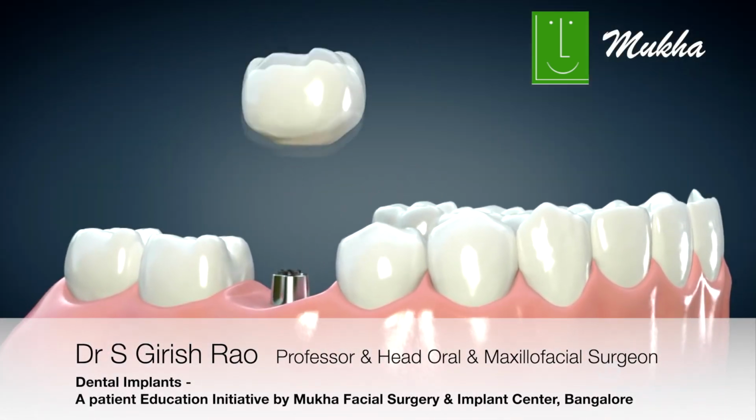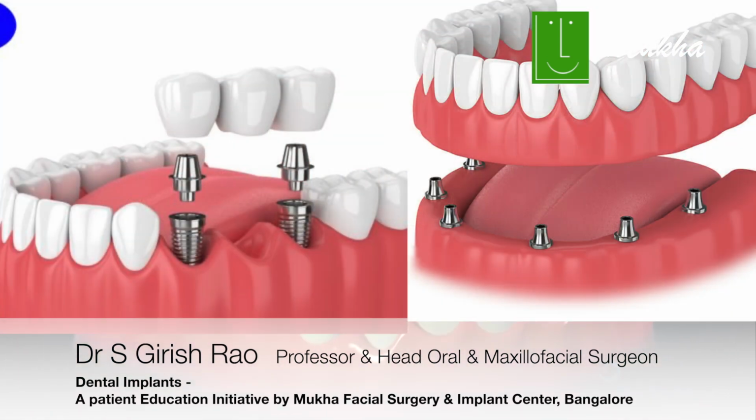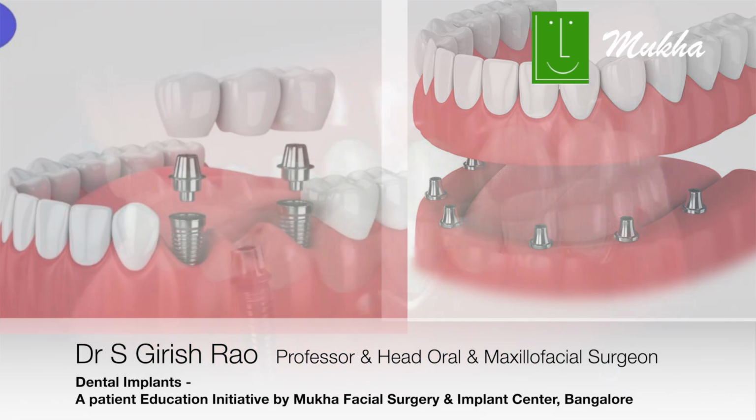It could be a single crown, or it could be a bridge, or it could be the whole denture itself, or replacement of your entire dentition can be done today with dental implants.